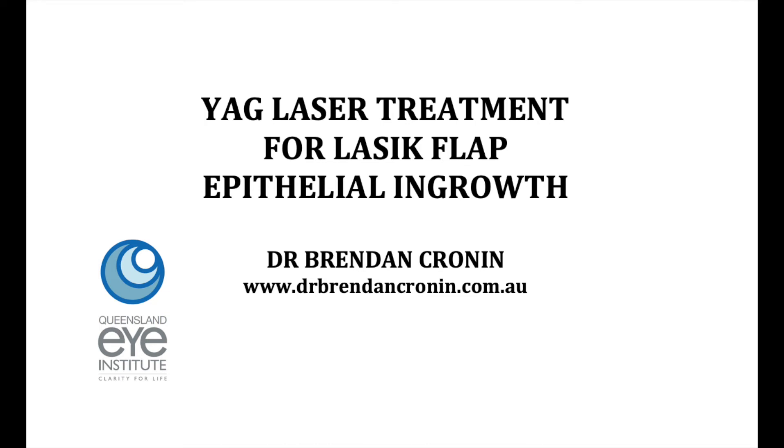This is Dr. Brendan Cronin from the Queensland Eye Institute, showing a case where I've used YAG laser treatment for LASIK flap epithelial ingrowth.